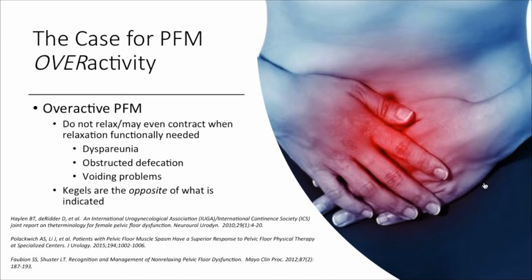Now, that said, there's a little bit of a gap. So looking at conscious contraction of the pelvic floor muscles, there's literature to look at activating the pelvic floor before and during increased abdominal pressure, or more of a bracing mechanism. There's also research that looks at indirect pelvic floor muscle training via the transverse abdominals. And again, with access to ultrasound to look at the abdominals, that's definitely viable.